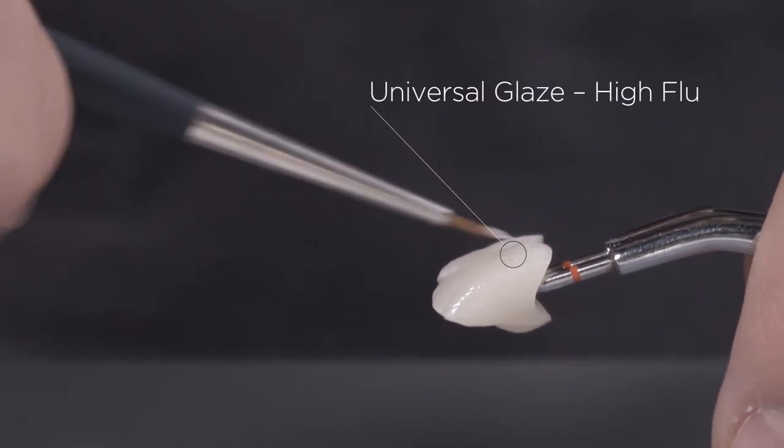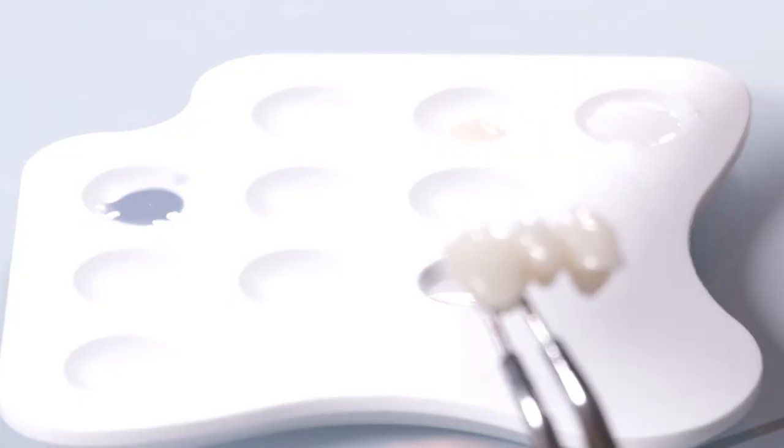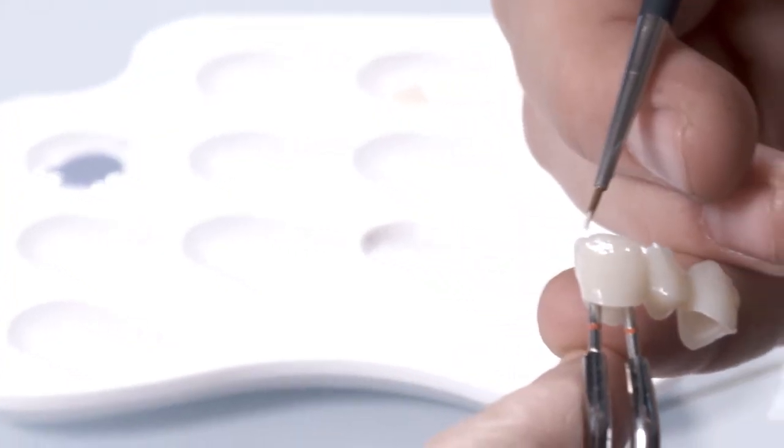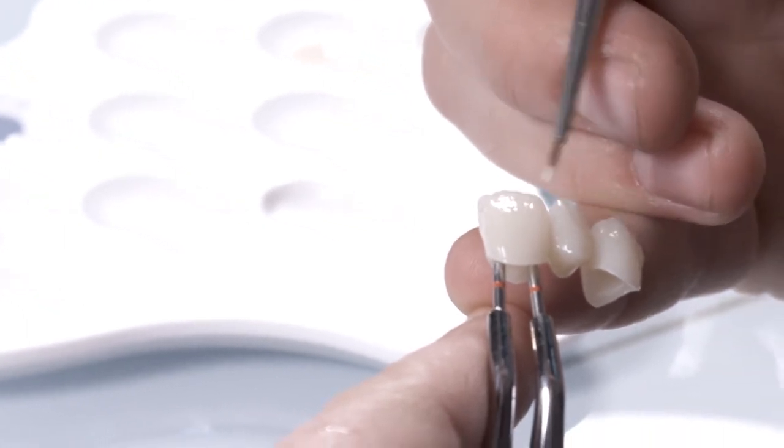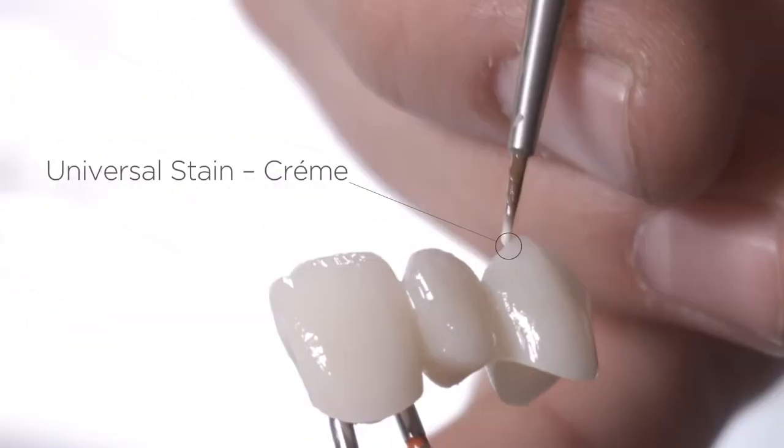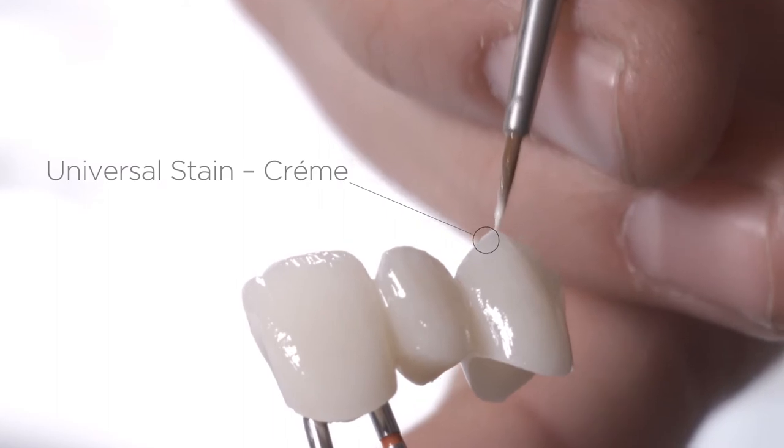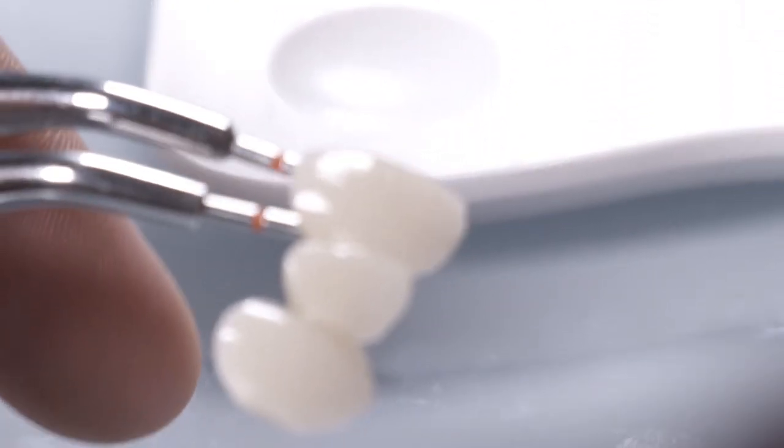With this method, finalization with glaze and stain is achieved in a single step. Paint a fine hem on the incisal edges with cream. Then complete the posterior incisal edge with Incisal Stain E1.